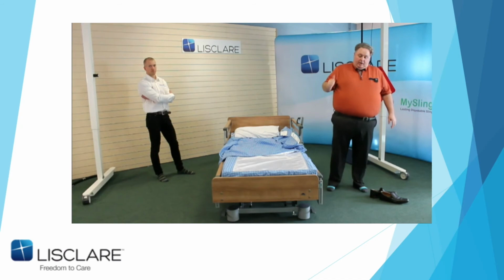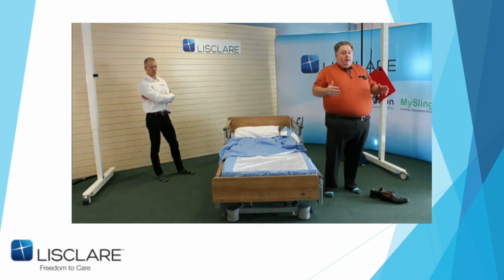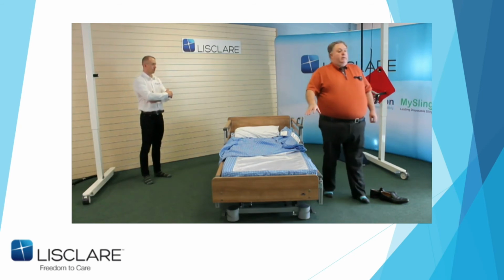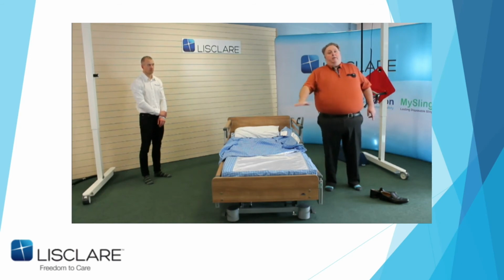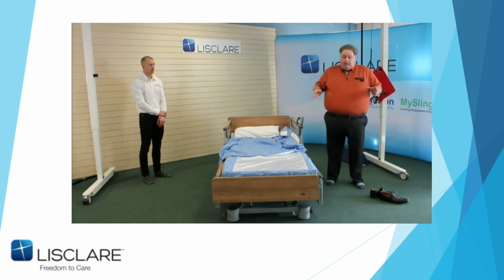Going back to it, first of all, air mattresses. I've noticed a lot, and it doesn't matter where I've been in the countries, England, Scotland, Wales, Northern Ireland, and Southern Ireland, carers are told not to touch the box on the air mattress. And that's the first problem. On all good quality air mattresses, and I would say most of them now have it, there is a static button. That static button is for you to do manual handling. When you press it, the air mattress becomes firm for manual handling for 10 minutes, and then switches itself back to alternating. It's in the instructions, but for some strange reason, a lot of that gets lost in translation.